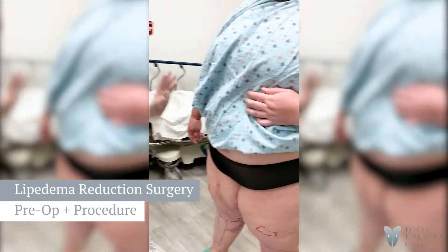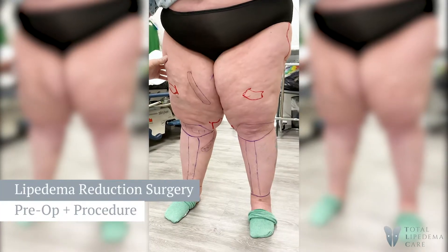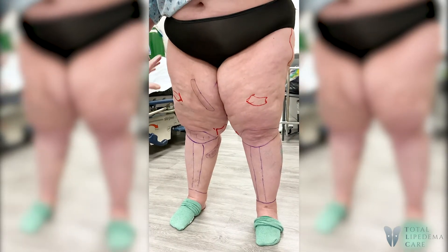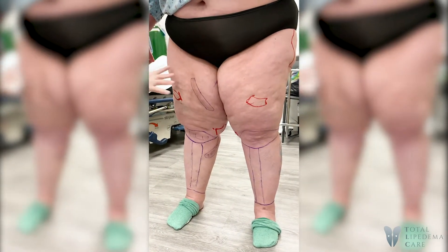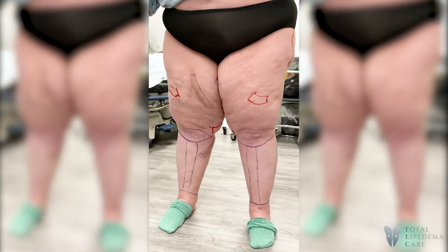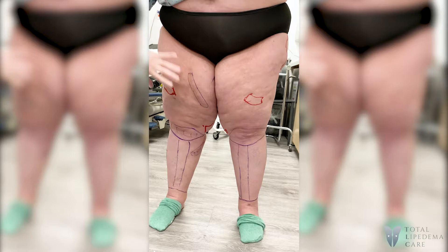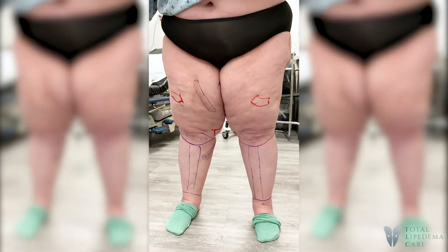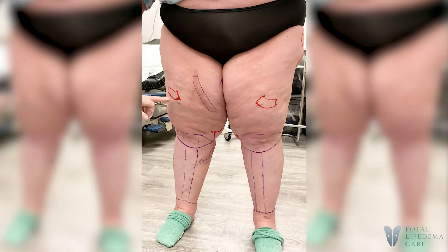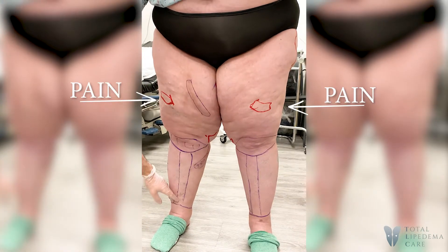Today we're going to do the front of the legs. I'll try to get as much as we can, coming as far back as possible. The reason I'm starting in the front rather than the back is because you're such a big volume here. Sometimes it's good to get even some of this, and if we do something else, get the other half. It's interesting that most of your pain up here is not so much down in this area anyway.